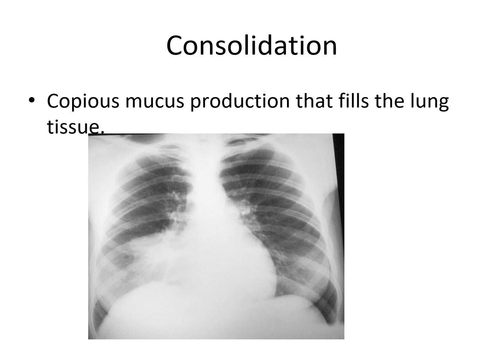And then this is our last slide, and this is basically showing a consolidation. So we have some really thick mucus plugging going on. They could possibly do a bronchoscopy on this patient to see if they could get out a bunch of secretions and kind of open that lung back up.